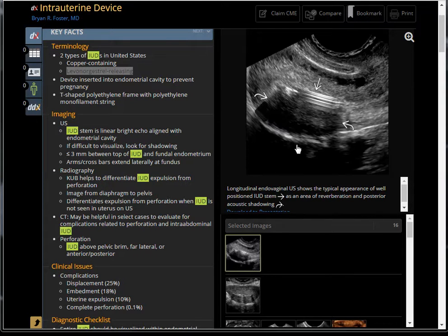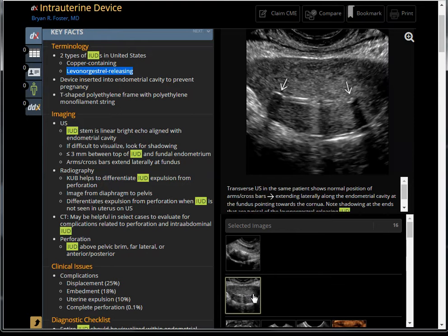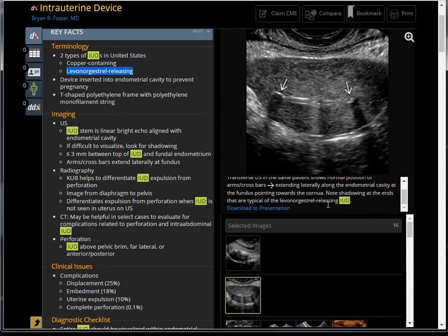The copper IUD can be easily seen on ultrasound. You can see an echogenic straight line with reverberation and shadowing. However, with the Mirena device, you can see shadowing at the tip, but it's not very echogenic and there's not much reverberation.